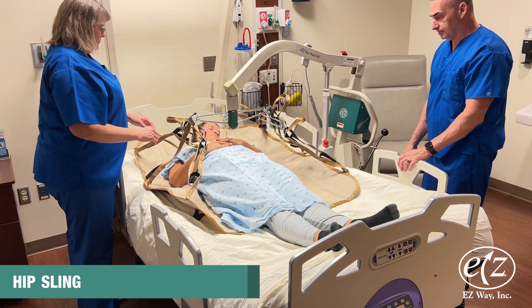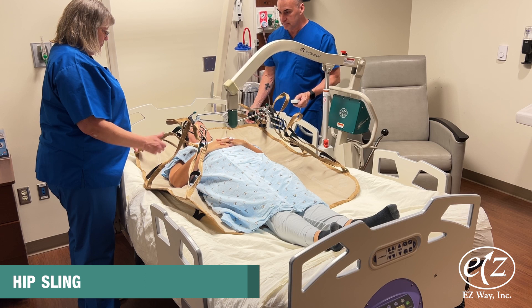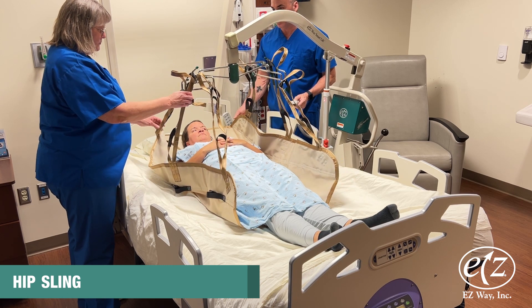After ensuring that all loops are connected, raise the person slightly. Once there is tension on the loops, pause lifting and double check to make sure that the loops of all six straps are seated in the hooks.